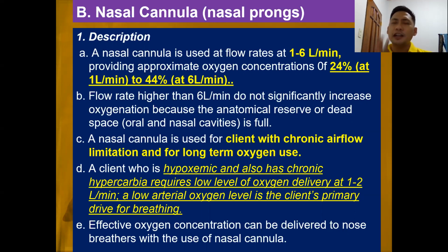Okay, so at 4 liters per minute or below, it is acceptable not to use a humidifier. More than 4 liters per minute, it is already irritating due to continuous air passing to your respiratory tract, and it does not pass through normal humidification in the nasal cavity. Then it needs to be humidified.